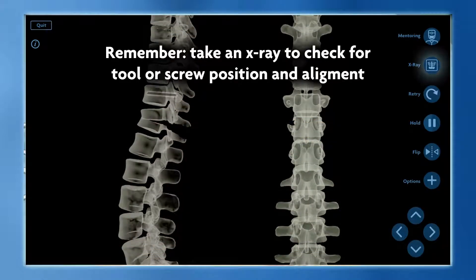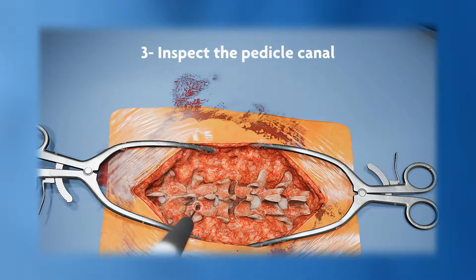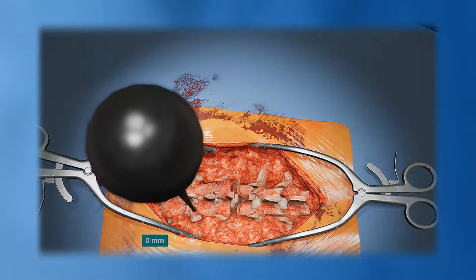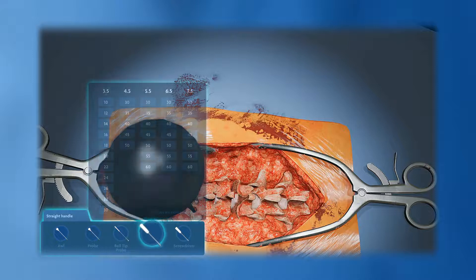At any time during the procedure, you can take an X-ray to check for tool or screw position and alignment. Inspect the pedicle canal using the ball tip probe to check for wall breaches. If a breach is found, consider adjusting your trajectory. Use the probe to measure the length of the track to identify which screw to use in the screw selection panel.